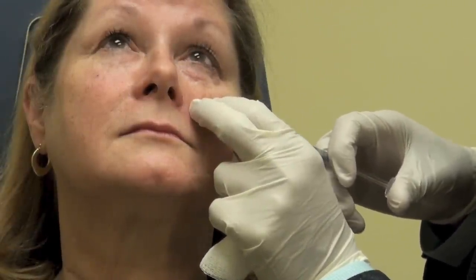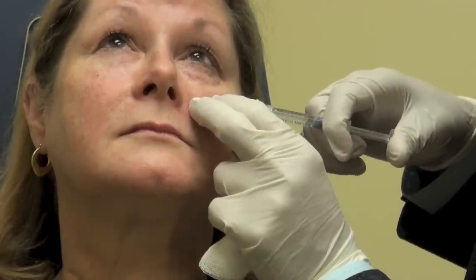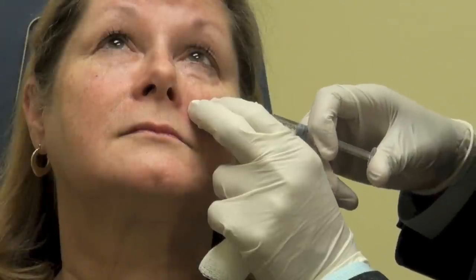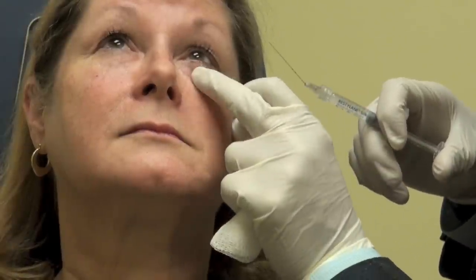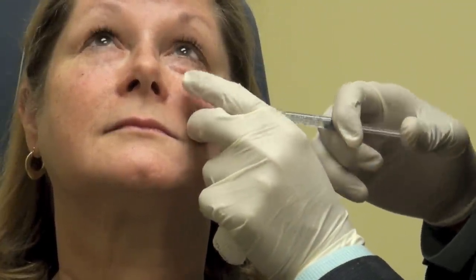When I do under eye filler, I generally ask to see people back a few weeks later to double check that we got everything just right, and if need be we'll fine-tune on that visit. For out-of-town patients, we try to accomplish it all on one visit. Eyes up to the ceiling again — so we've made some progress; you can see little areas where there are valleys that still need to be treated.